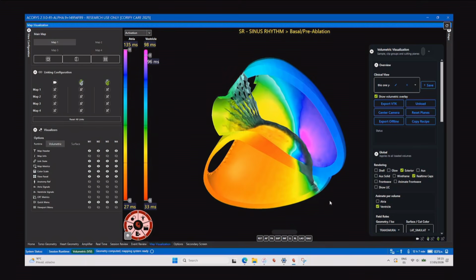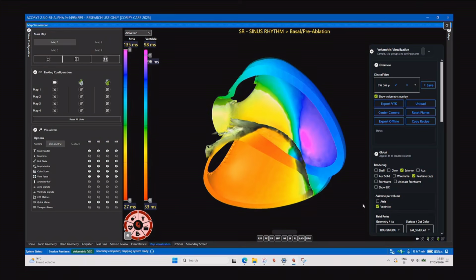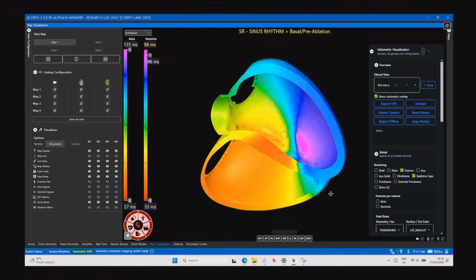The thing about ECGI is that it always tells you the most arrhythmogenic area. If you have three areas, probably the slowest ones are very nicely seen by the ECGI. Now we are refining the S3 protocol with the ECGI also to see it, but this is still in process. But you see clearly the slow conduction you can have in this patient, you see it here. Okay, can we move to the inside again, please?